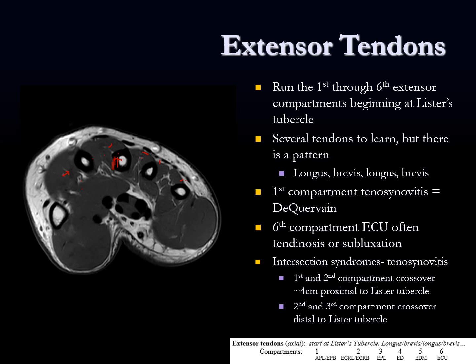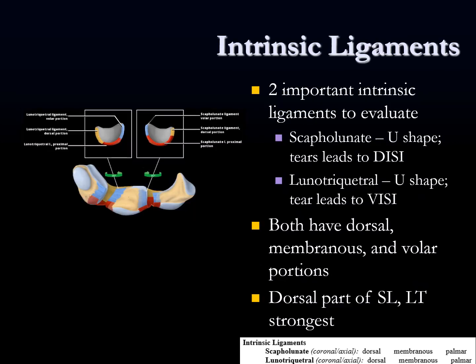There are intersection syndromes where those compartments cross over at those points, so you can look for fluid or tenosynovitis in those tendons. Then we can go to the intrinsic ligaments of the wrist. There are two important ones to evaluate: the scapholunate and lunotriquetral ligaments. There are small ligaments between all the carpal bones, but those are the two that you need to know about.